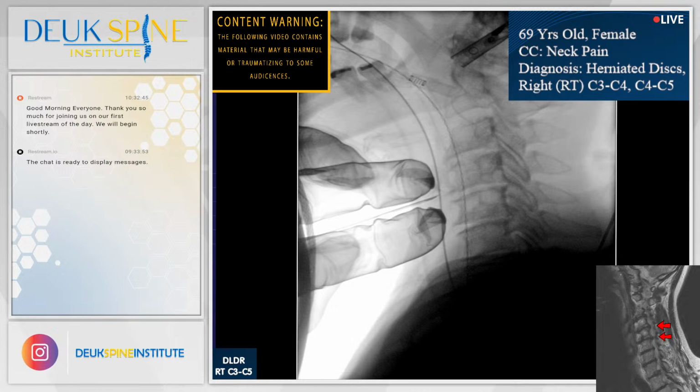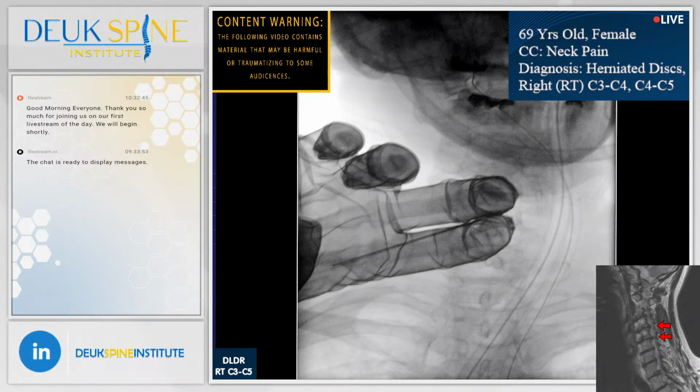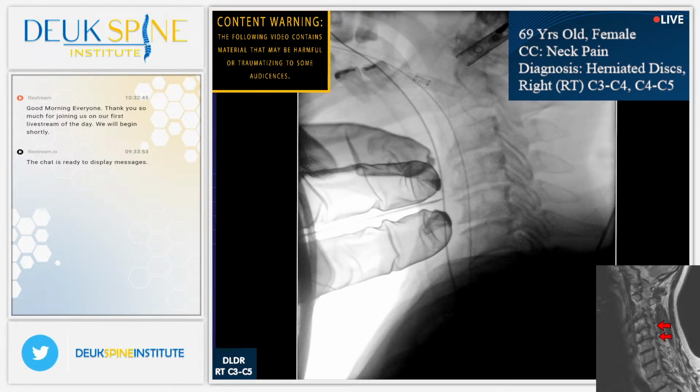Let's get an AP view. My fingers are displacing the soft tissues to feel the spine. When the patient is asleep, good, lateral. You can actually palpate the spine with your fingertips as long as they're asleep and relaxed, and she is. All right, so I'm going to go in, shot.